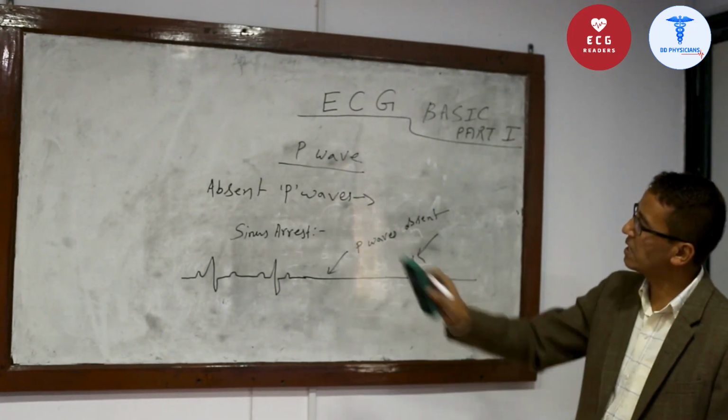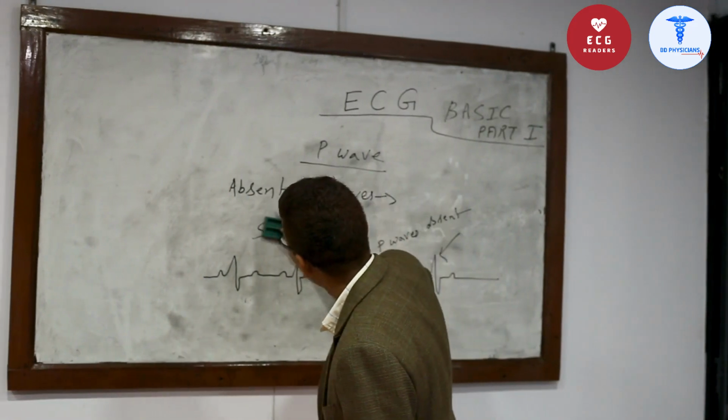So we can distinguish sinus arrest from sinoatrial block.